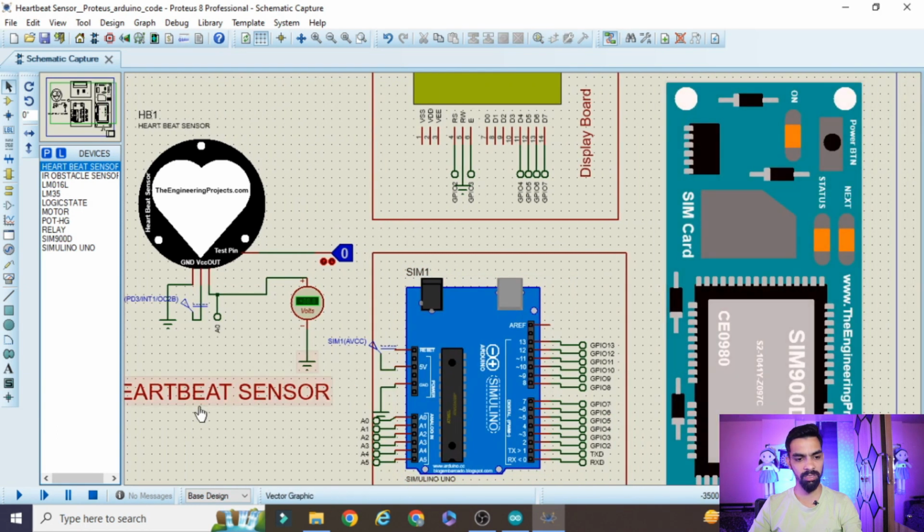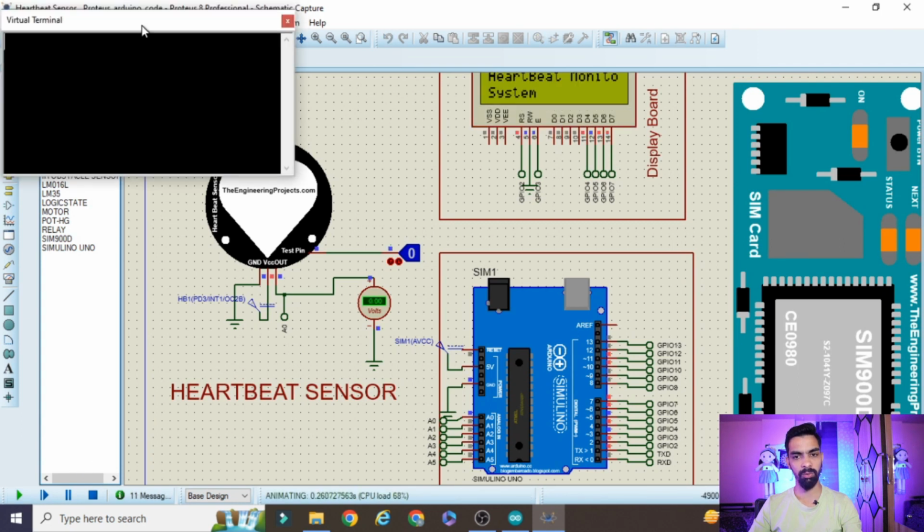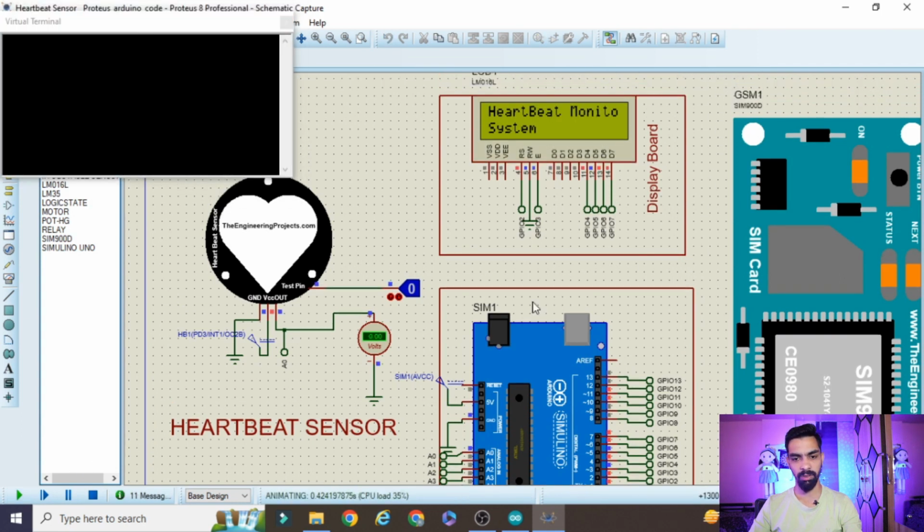Now just click on this Run button. Once you click on Run, the project starts working, and you can see "sensor not detected". Then you can give one signal, then "hyper slow pulse detected" appears, and you can easily run this project at your end. So I hope you understand the complete project.